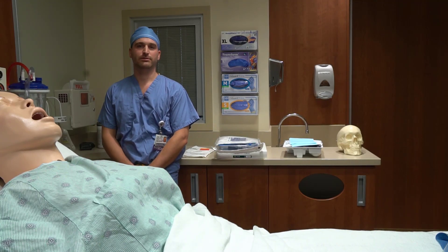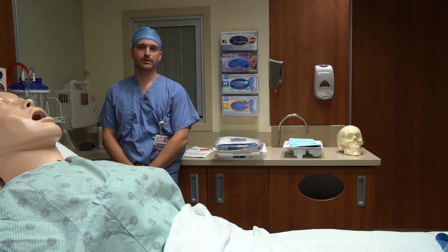Hi, my name is Nate Nordman. I'm a PGY3 with SIU Neurosurgery. We cover both Memorial and Saints. Today we're going to be talking about how to properly insert, place, zero, and monitor with the Camino ICP monitoring system.